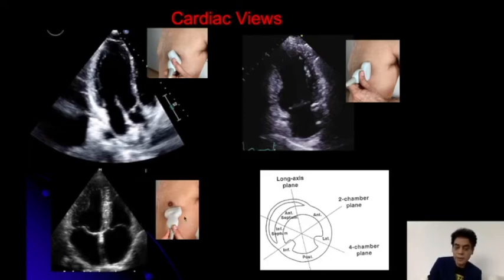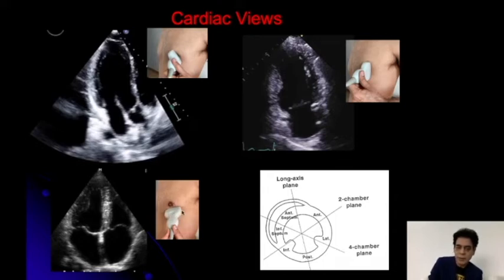How do we get this section? We get this section somewhere close to the nipple area — a little bit up or down. We are keeping the probe transversely and tilting it towards the right side. That gets you all four chambers in the view, and we get this four-chamber view.